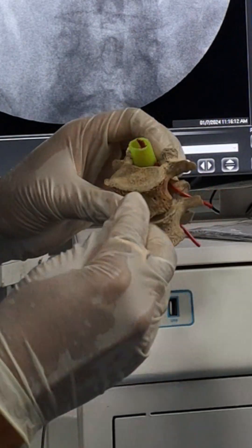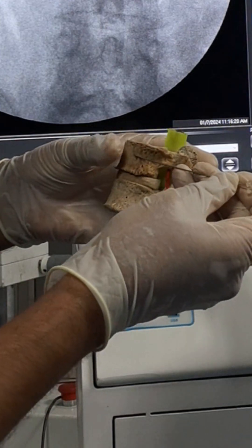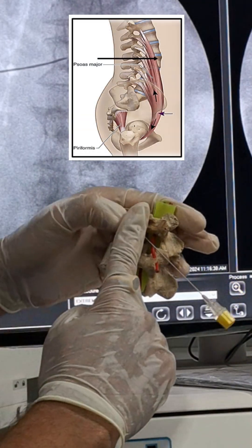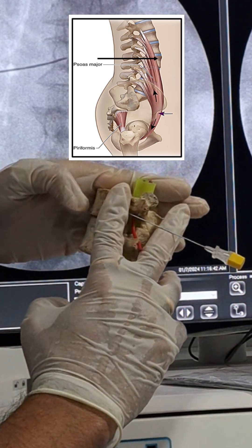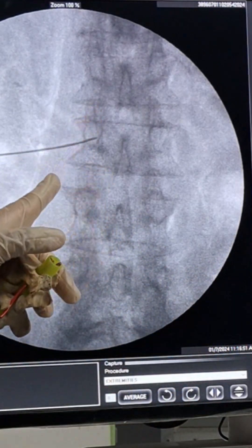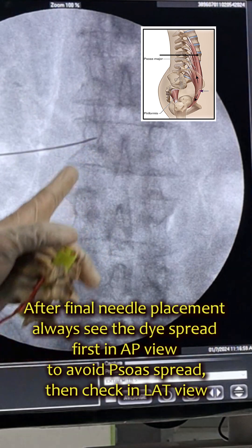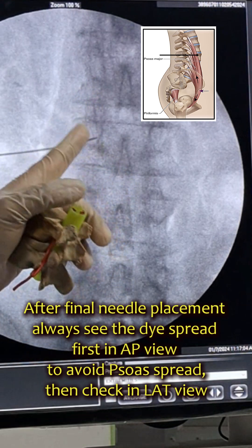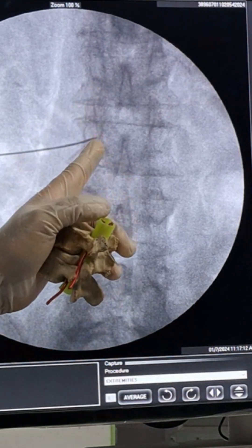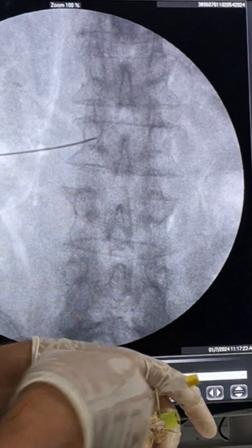Another important consideration: the psoas major muscle is here, so the needle must be anterior to the psoas line. If the needle is posterior to the psoas, when you inject dye in AP view it will spread laterally rather than up and down. At this position, first check dye spread in AP view. Inject only 1 to 1.5 ml — if the dye goes up and down, you are at the correct position. If it spreads laterally, advance the needle slightly further and check again.